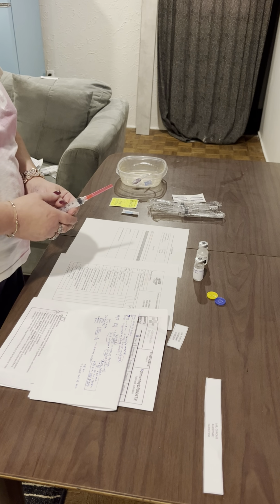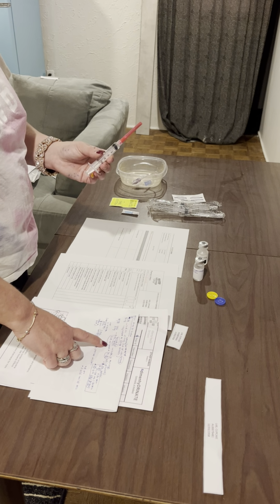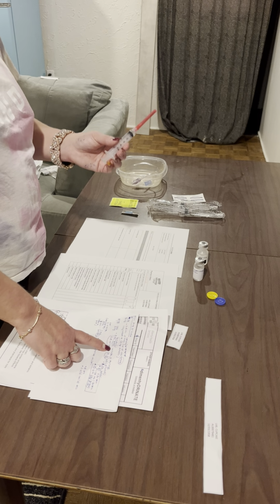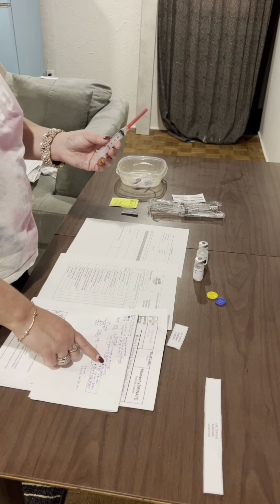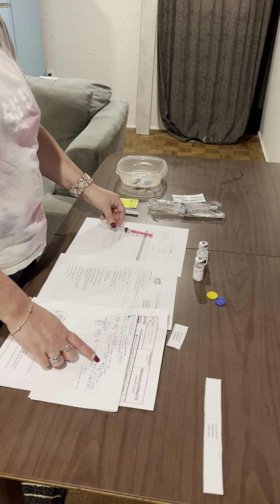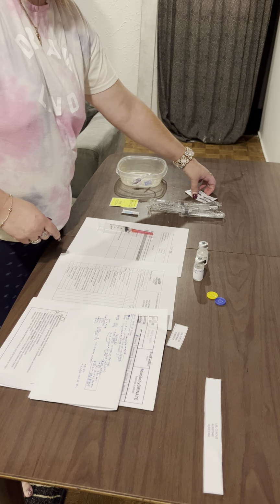So the next thing that we are going to do is look at our med math. Now that we have the med drawn up, we also see that we have to have 5 mils total in the syringe, and that 4.5 mils have to be the diluent, which is the normal saline. Okay, so the second thing we're going to do is draw up the normal saline.